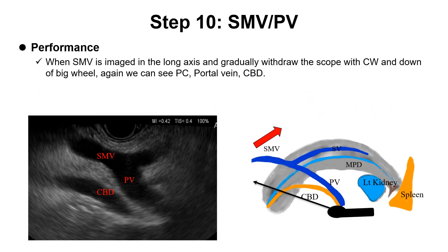Step 10: SMV and portal vein. When the SMV is imaged on the long axis, gradually withdraw the scope with clockwise rotation and big-wheel-down angulation. We can see the portal confluence, portal vein, and CBD.